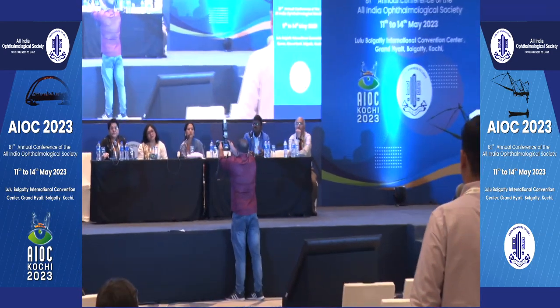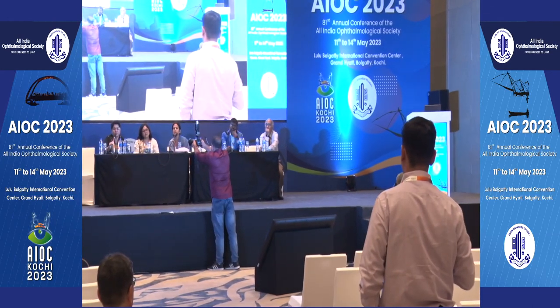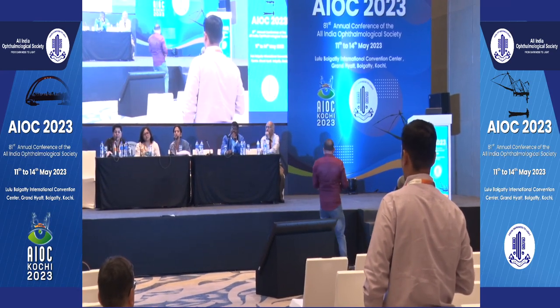Okay. Yes, Prabhu. I have a question. In stage 5 ROP surgery, how do you ensure that the globe doesn't collapse? And I would like to know your visual outcomes or overall outcomes in your experience. Post-surgery, you mean? Yeah. See, what happens is that when we have a stage 5, which is almost stage 5C now, as per the new classification, you're going to have a keratoplasty, which you have to do because the cornea doesn't allow you any kind of visibility.